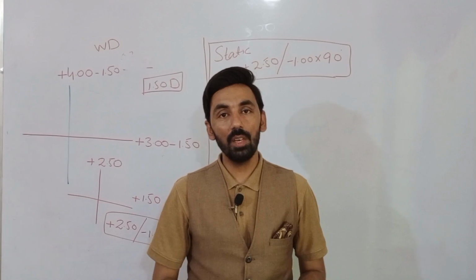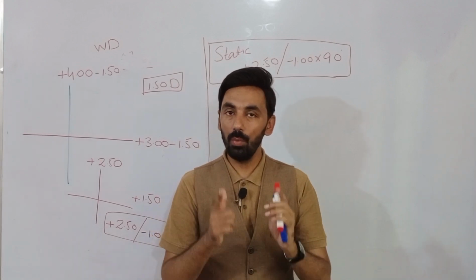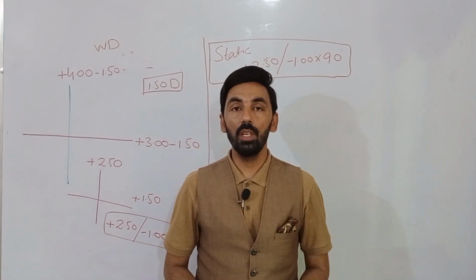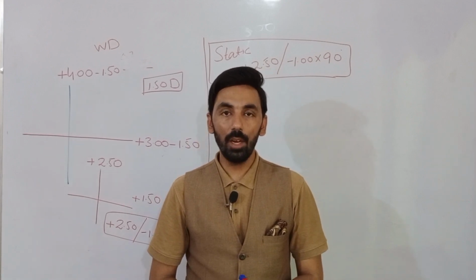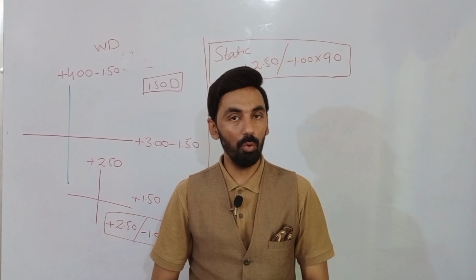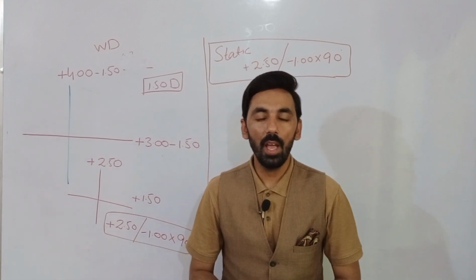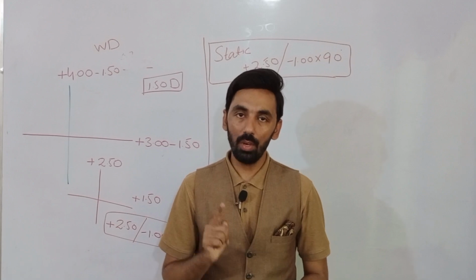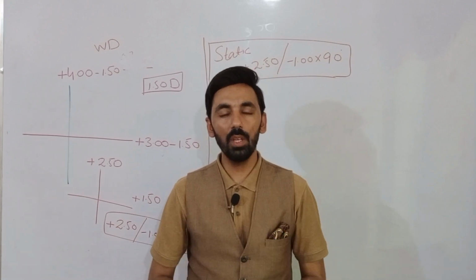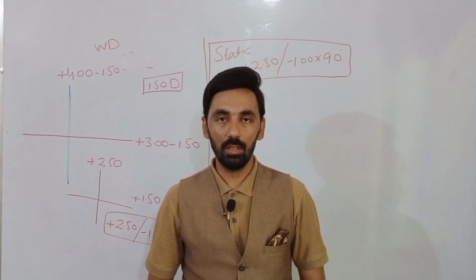Whenever there is a deficiency of plus power, we will find with movement. So in every patient with lag of accommodation, we will find with movement, and in every case of with movement, we always neutralize it with plus spherical lenses, right?